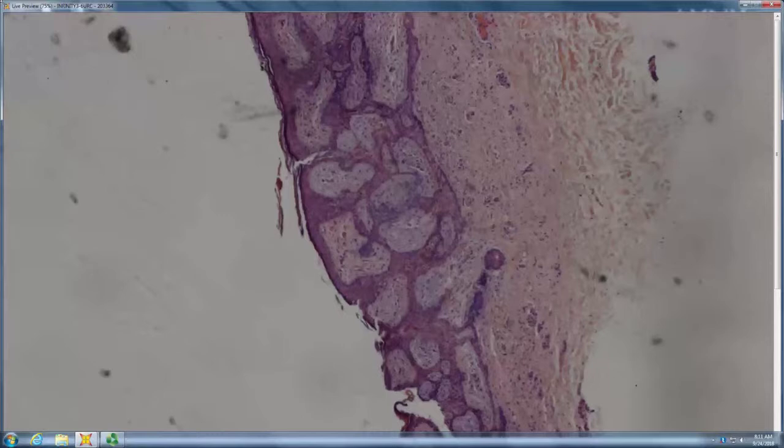And it has lots of fibroplasia as well as the epithelial. Oh, the pinkest. Pinkus tumor. It's a baby. So it's like a baby Pinkus. They got to start somewhere, right?